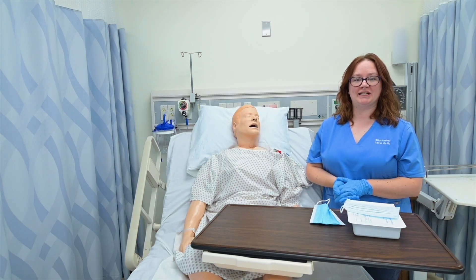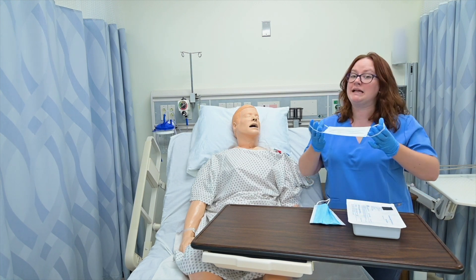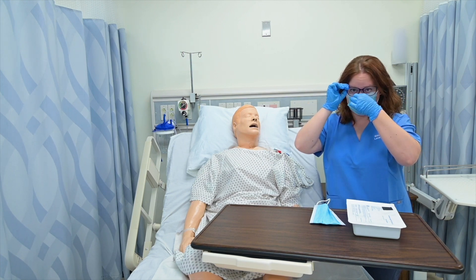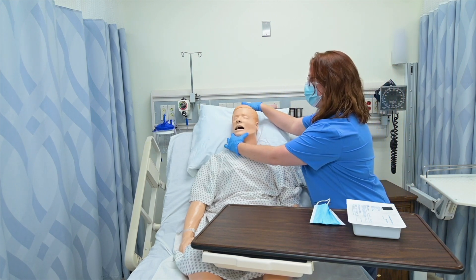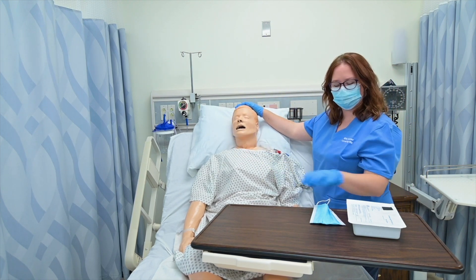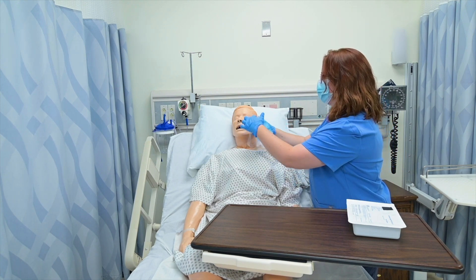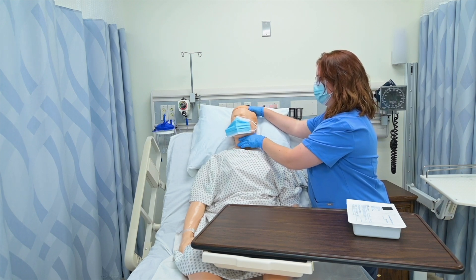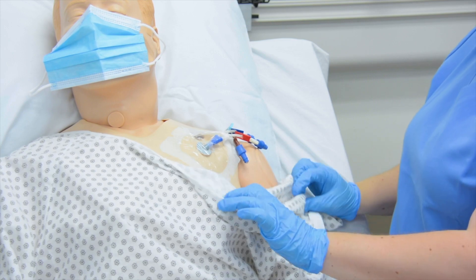To prepare to change my patient's central line dressing, I've already done my hand hygiene and put on some clean gloves. Then I'm going to put a mask on. I'm actually going to have my patient turn their head away from the side that has the site, and I'm going to have them put a mask on as well. I'm going to pull the gown down so I can see the site better.